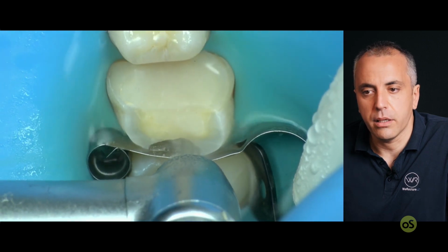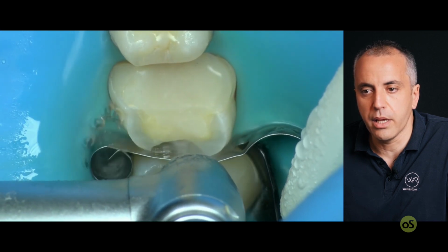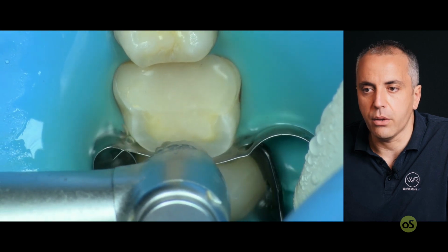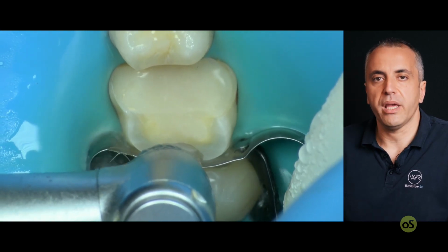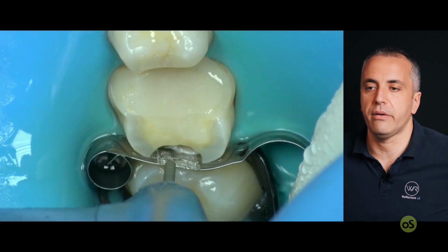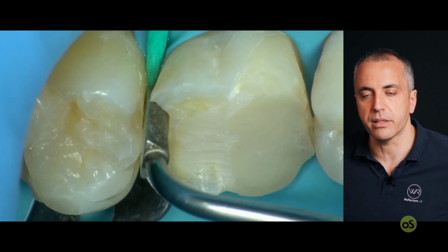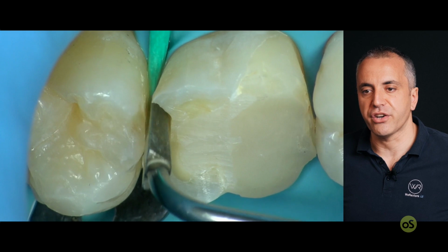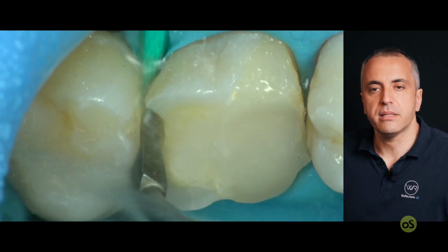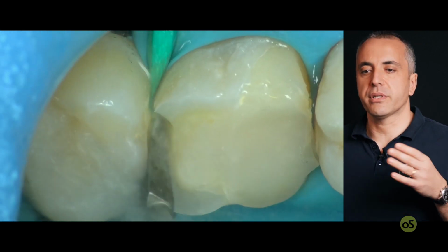As you can see, there is a slight demineralization on the distal part, and of course we remove it by preparing with the burr. The build-up was made in another appointment, so it's not an older restoration. It's a very good build-up that was made after the endo treatment, and there is also slight marginal relocation. You see there is a demineralization on the distal part, and this is a sonic tip.